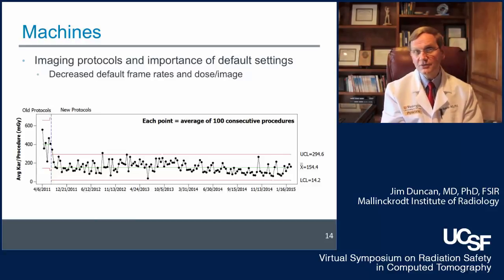If you wanted to up it, if you wanted to increase the frame rate or dose per image, perfectly capable, welcome to do it, but we're going to start at low and really getting people to start working through low dose imaging and finding that more and more procedures were completed with low dose throughout their entirety.